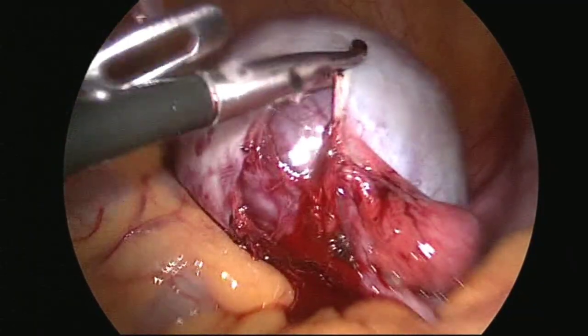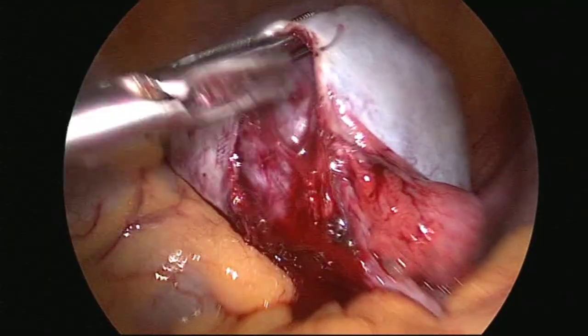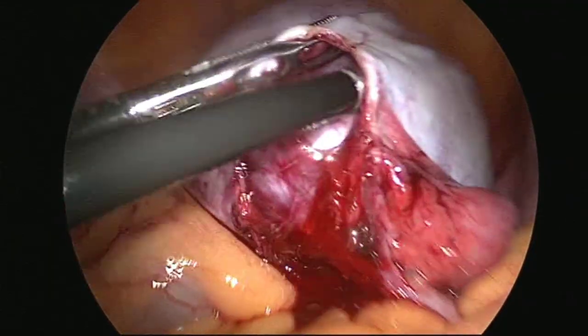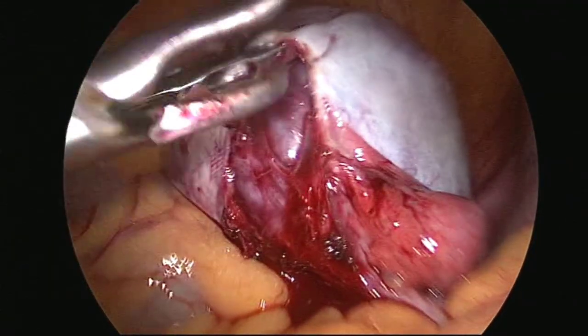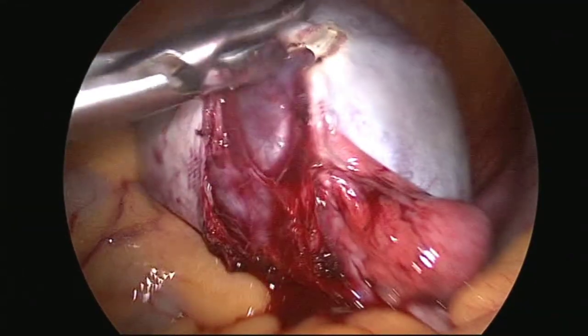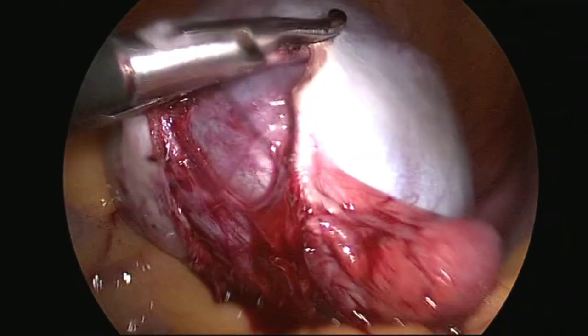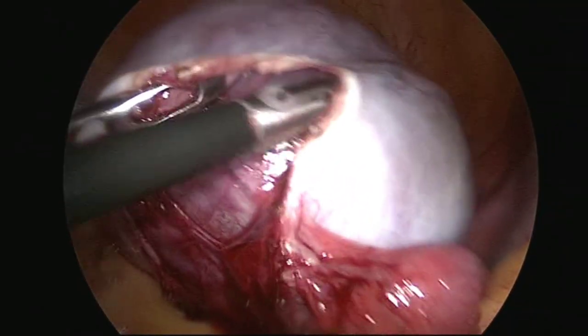Now you can see right now I am in a good plane and there is no bleeding at all. Now I just have to separate the cyst wall from the healthy ovary. There is very little healthy ovary. On the right side you can see there is a whitish margin. I will try to protect it.